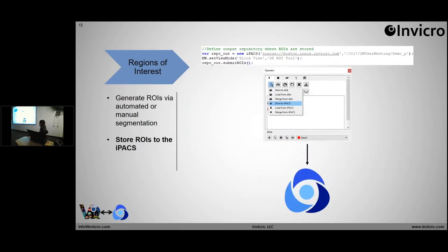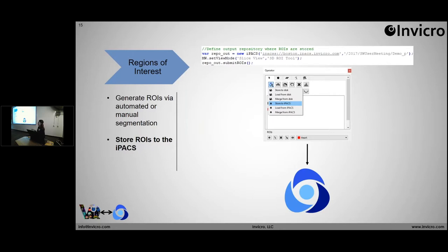Lastly, I mentioned the very seamless IPACS integration within VivoScript. You can submit your ROIs and data to the IPACS using single-line code — just repo.submitROIs — very easy and user-friendly. When you submit your ROIs to the IPACS, you're also submitting the quantification data point, which is the quantification data associated with each ROI.